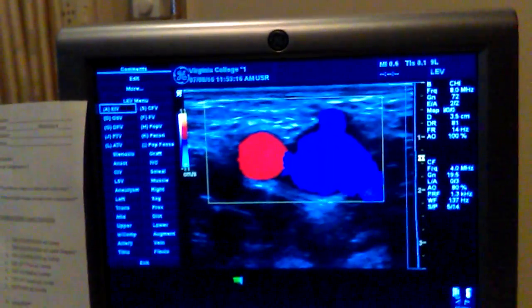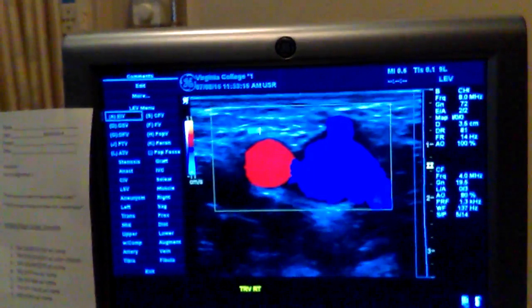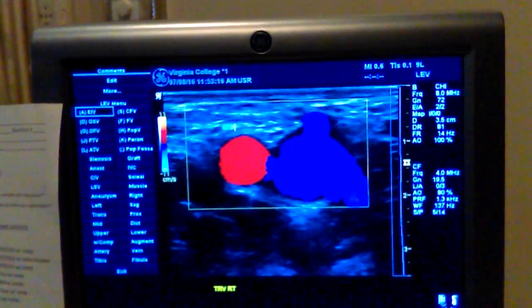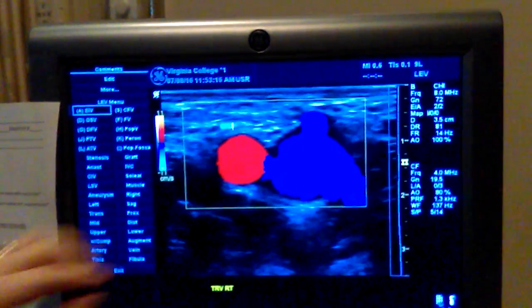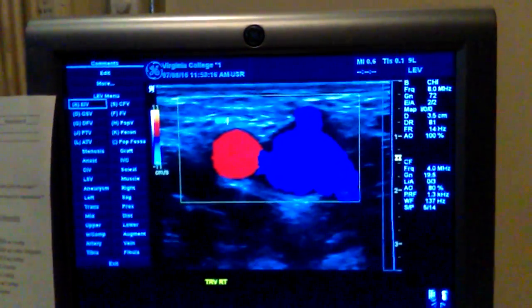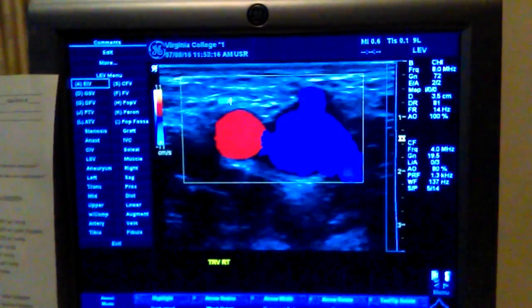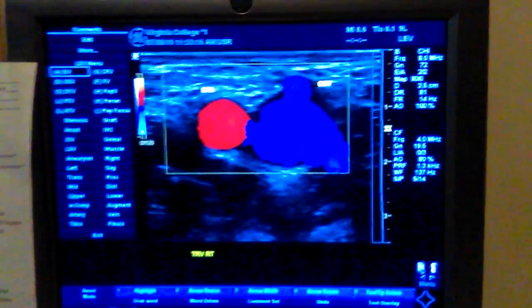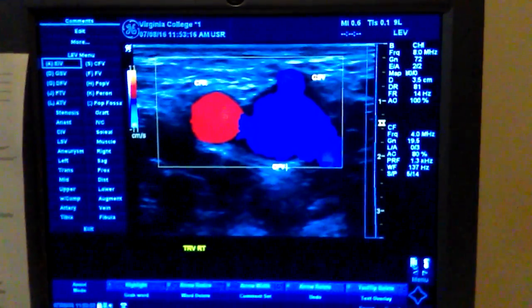Still, we would annotate the orientation, transverse, doing the right leg. Still come up here. So our patient does not bifurcate early, so this is still CFA. On some people, or really like half the people, you'll see two arteries right here, and it'll be the SFA and the PFA. Okay, I'm still getting people trying to put CFA and then PFA. That's not right. All right, and then over here, we'd still want to label GSV and the CFV. Okay, and so that's your second image.